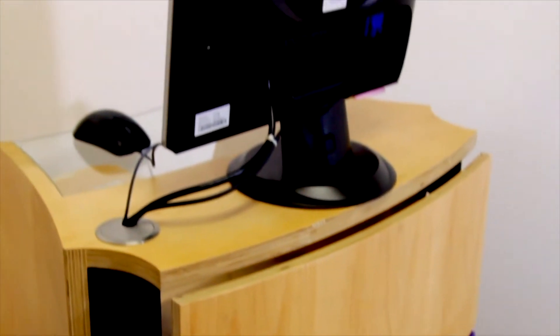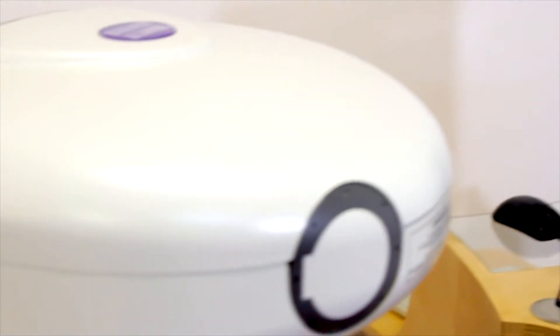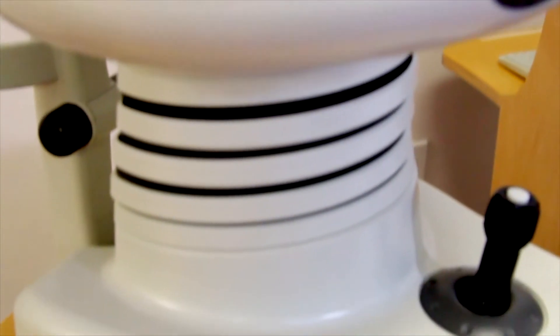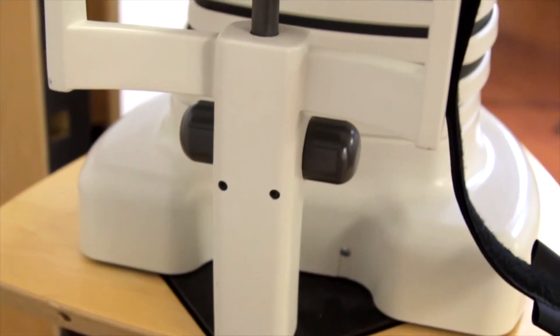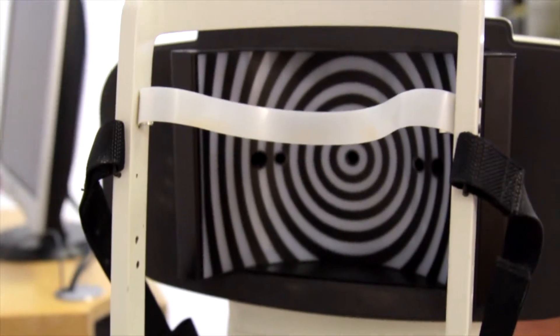Unlike current topography systems which scan the surface of the eye at standard points, the OrbScan2 acquires over 9,000 data points in 1.5 seconds to meticulously map the entire corneal surface.